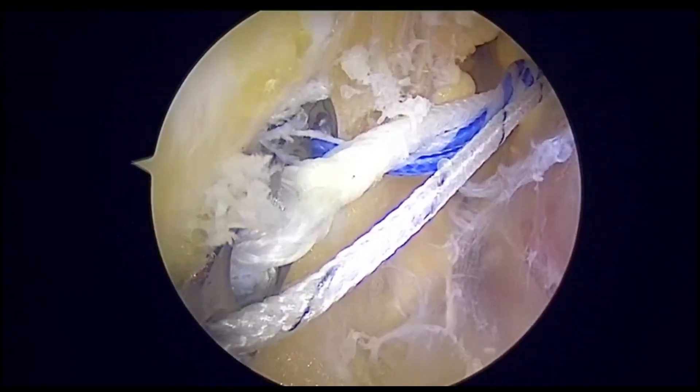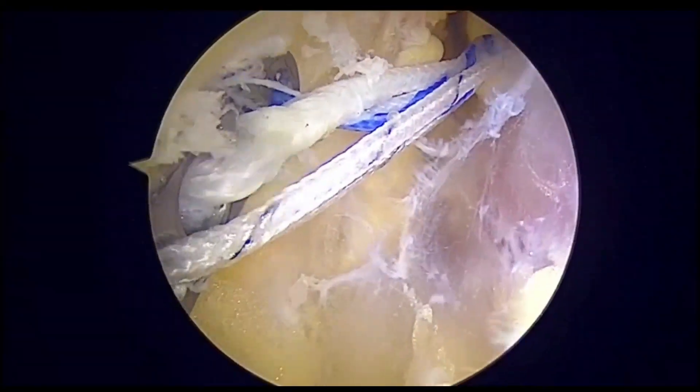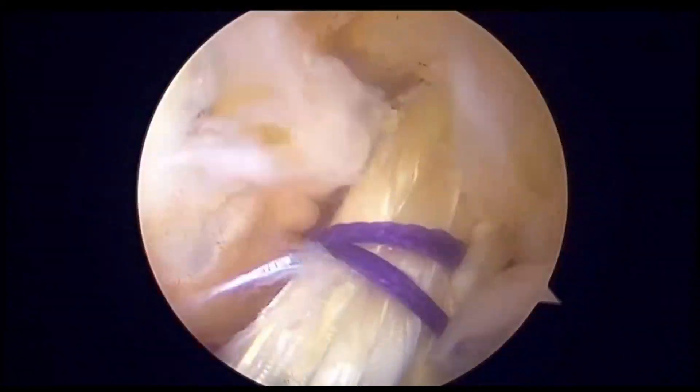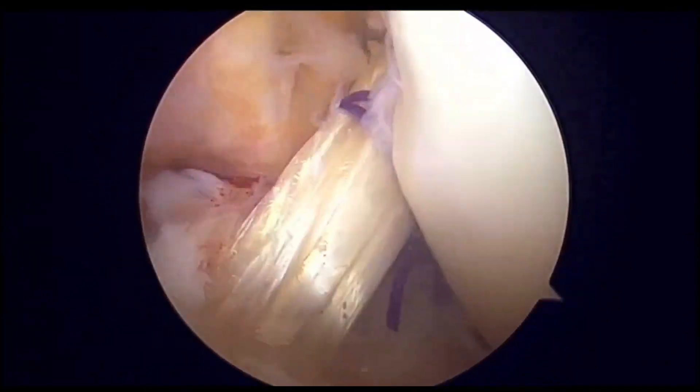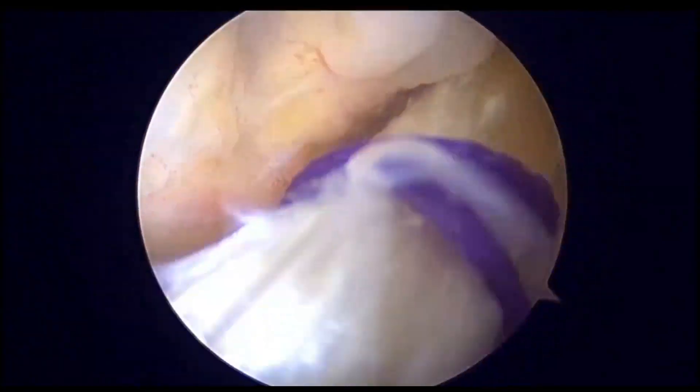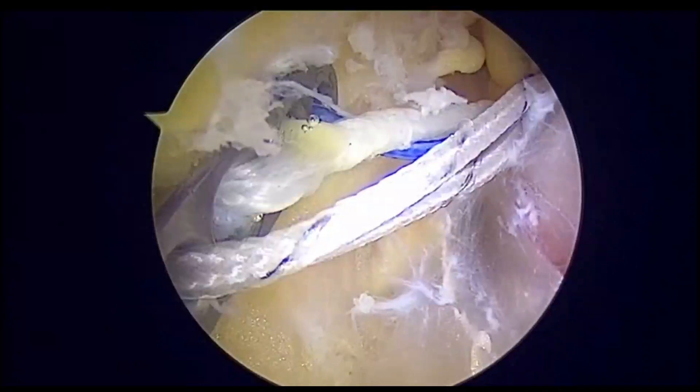Here we can see that the white loop can now be cinched to shorten the loop. You can confirm it with the intra-articular view, where you can see intra-articular pulling of the graft once we start cinching the loop. You can confirm it from inside as well as outside.